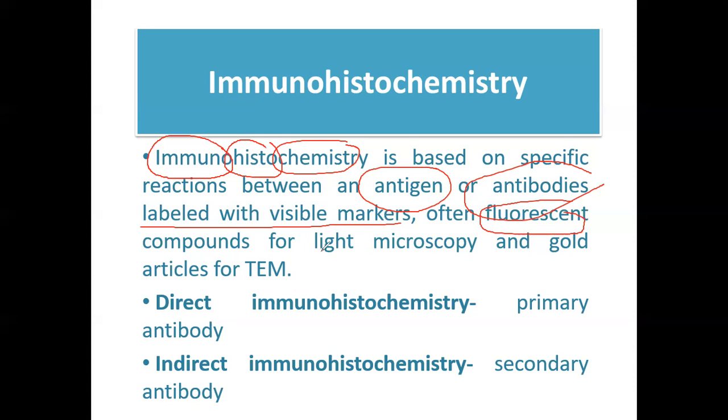So, guys, in your immunohistochemistry, we're talking about antigens and antibodies. As I mentioned a while ago, we have two basic techniques: direct and indirect. Tandaan ninyo, in direct immunohistochemistry, we can detect the presence of an antigen through the labeled primary antibody. So yung label dito is yung primary antibody. Actually, isang antibody lang ang ginagamit natin.